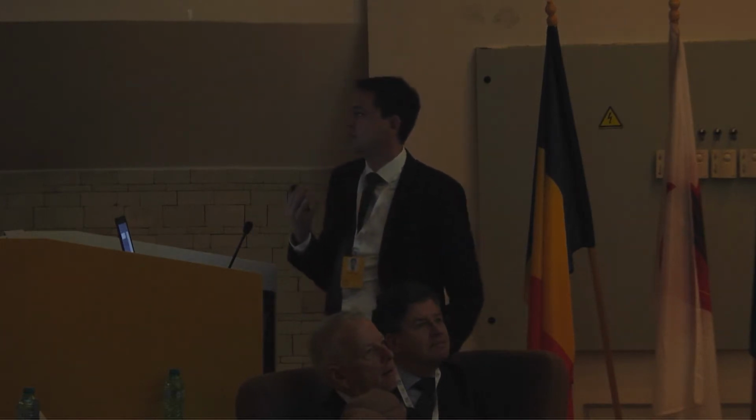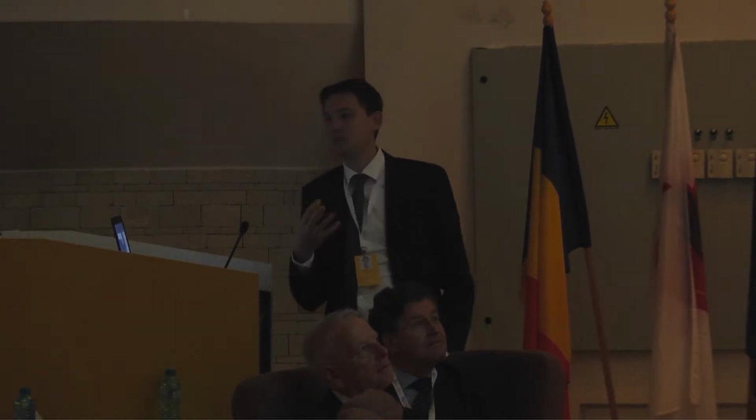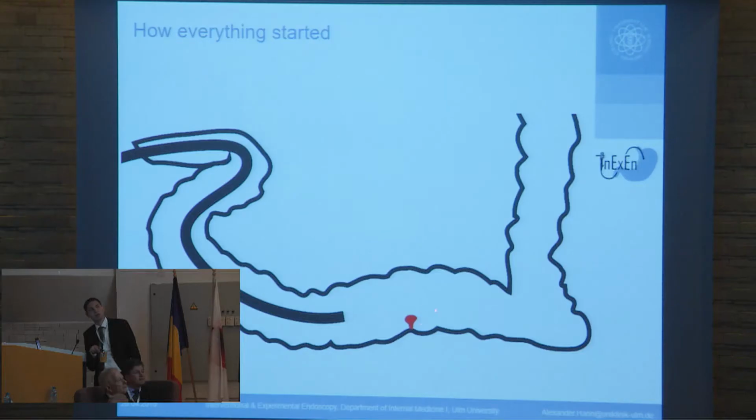So we were thinking about using this technology in gastroenterology and in endoscopy. This is how everything started. It was a project last year where we were thinking about how we perform endoscopy. Usually the camera of the endoscope just looks forward, so you have a hard time detecting flat lesions that are on the side of the folds.